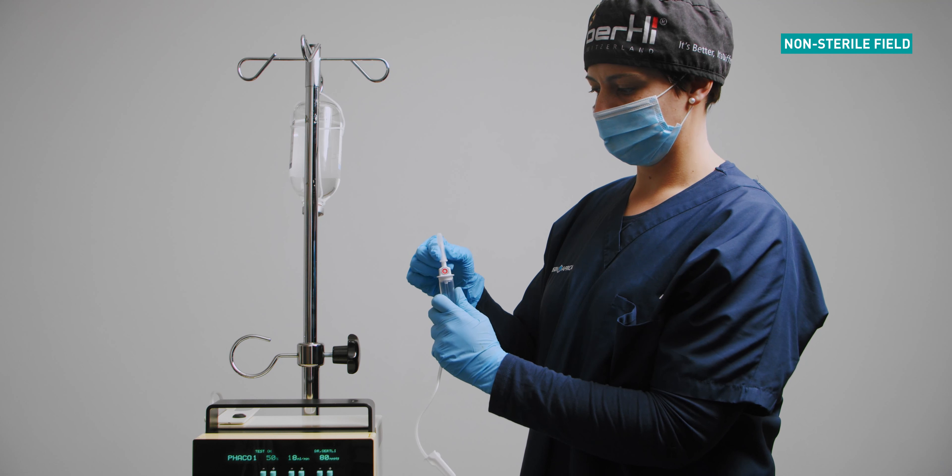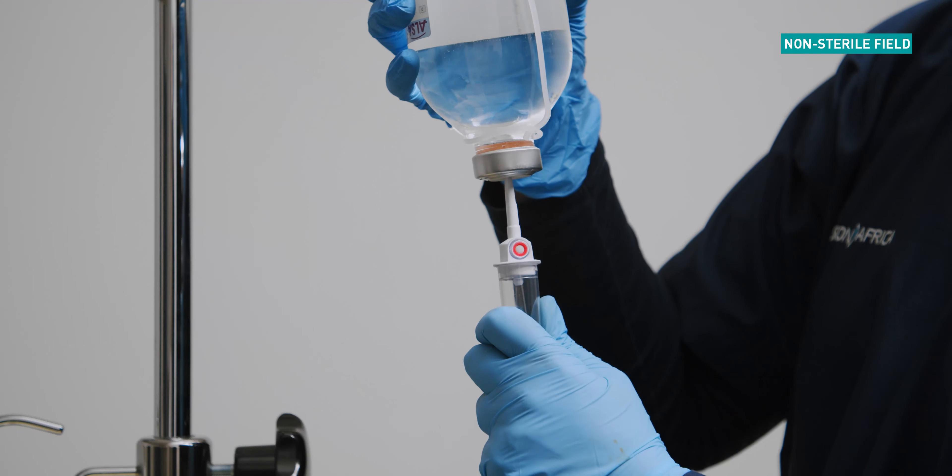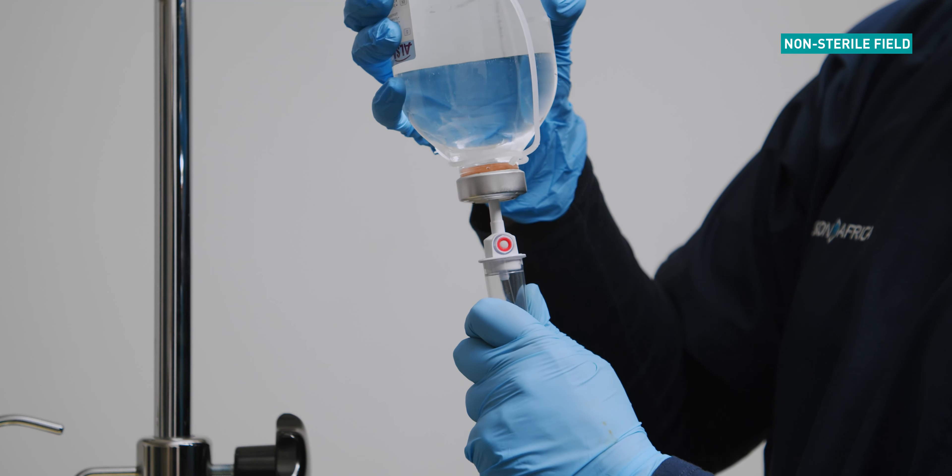Connect the admin set to the BSS bottle. Fill the chamber halfway with BSS by squeezing.